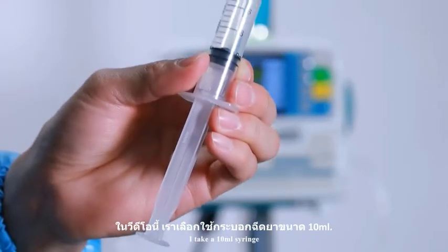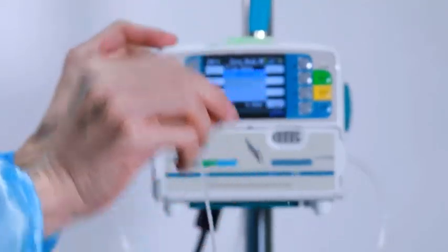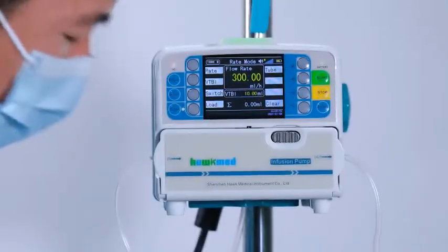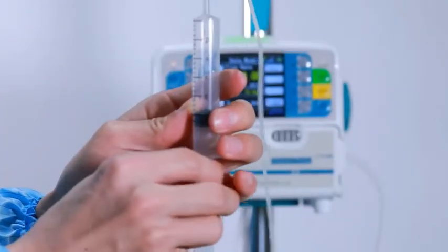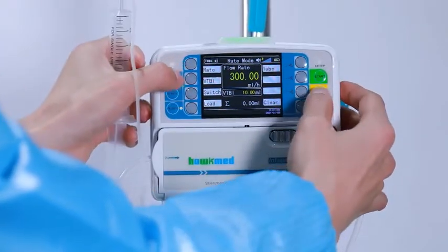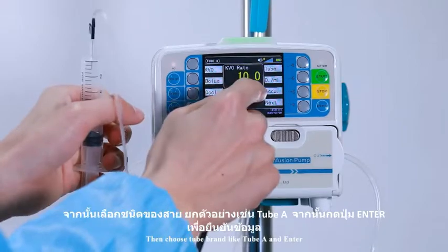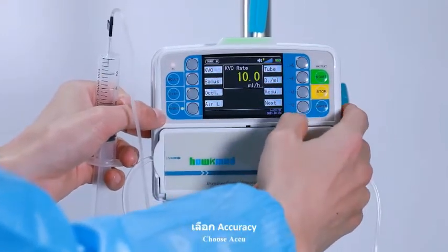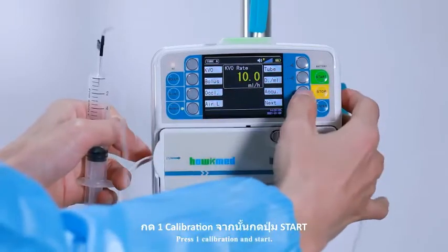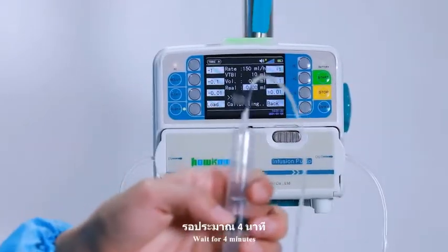I take a 10ml syringe. First of all, we need to clear the air in the line. Put the needle into the syringe. To calibrate a new brand of IV set, press stop key plus the top soft key on the left to get into the setting interface. Then choose tube brand — for example, Tube A — and press enter. Choose the queue. Press 1 for calibration and start. Wait for 4 minutes.